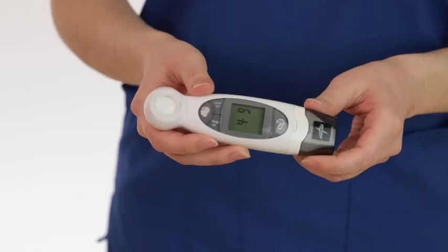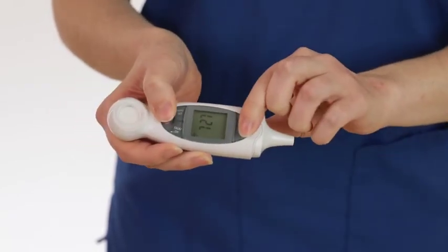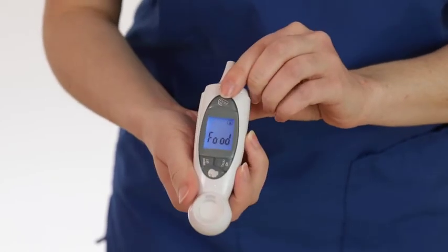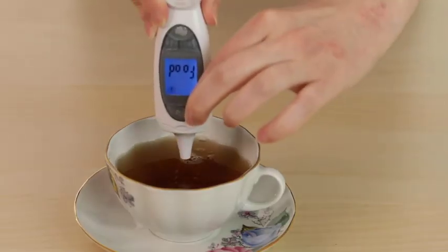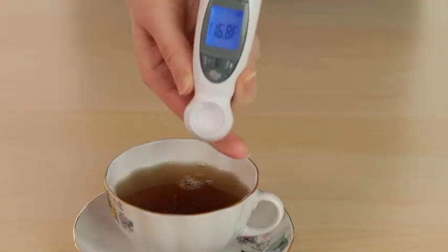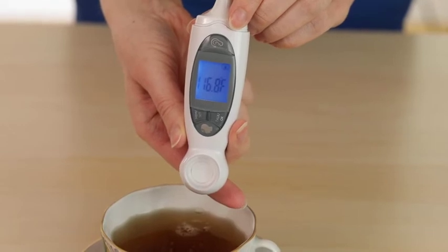To measure the temperature of an object, first press the forehead and ear button simultaneously to enter object mode. When you are in object mode, the word 'food' will appear on the screen along with a bottle icon in the upper right hand corner. Hold the probe within one centimeter of the surface you want to measure and press the ear button. You will hear a beep or a voice announcing the temperature when the measurement is complete.